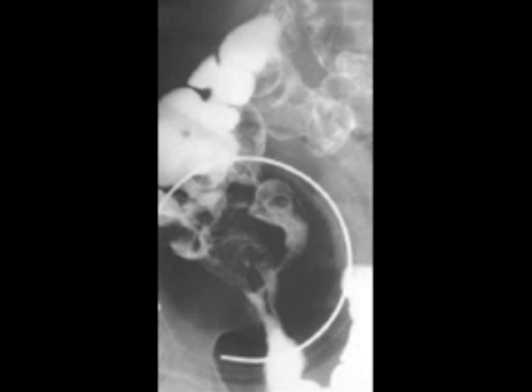Typically, though, in cases where the contrast is suspected of reaching the end of the small bowel, also called the terminal ileum, the fluoroscope is used to image the junction between the small and large bowel called the ileocecal valve. A radiologist is the only person licensed to run a fluoroscopic tower, but a technologist may perform this under direct supervision of a radiologist. A paddle with a pressurized, air-filled center may be utilized in order to move the bowels into a good position for an image, as seen by the white circle in this image.